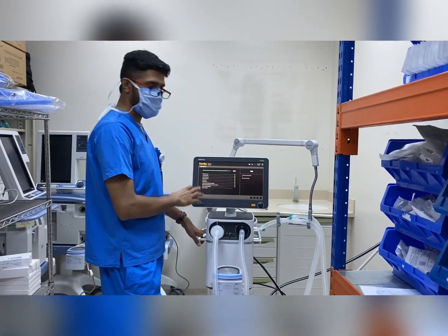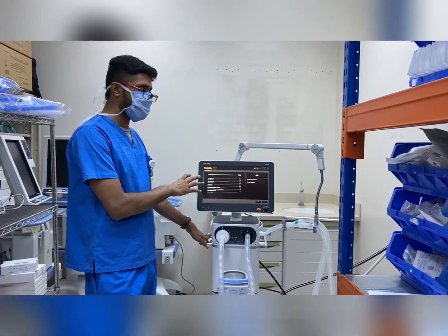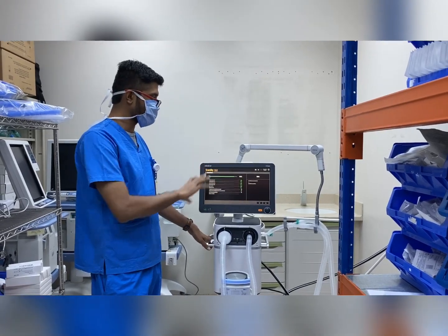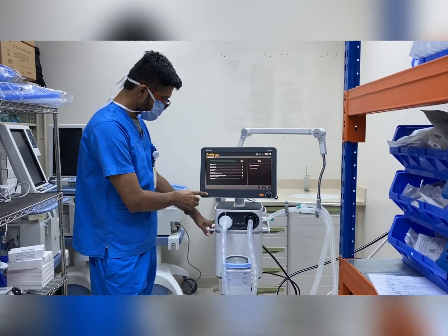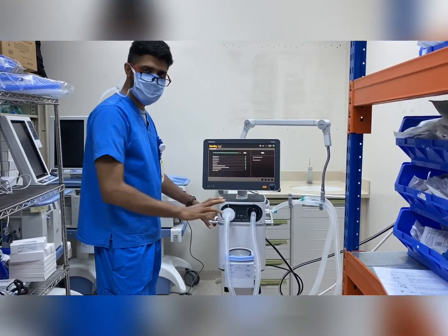This is the Midray SV600 ventilator and we are going to give a small demonstration on how to use this machine. This is the on/off button and this is the adjustable knob.